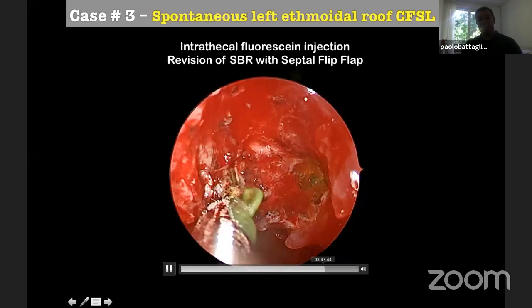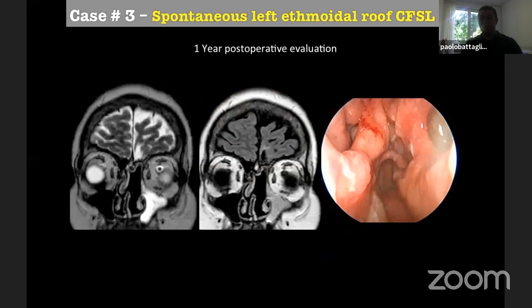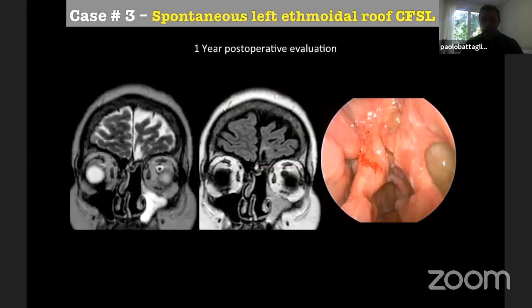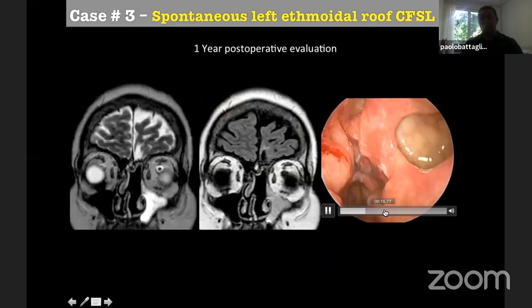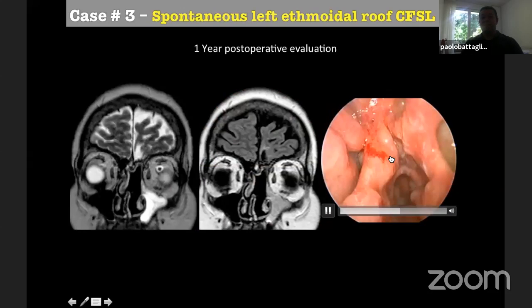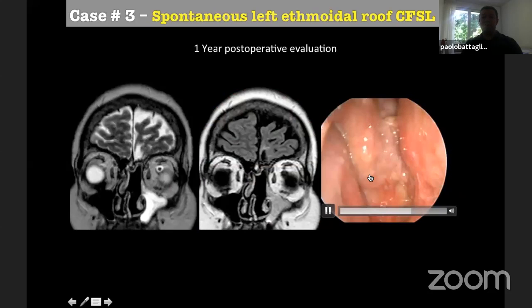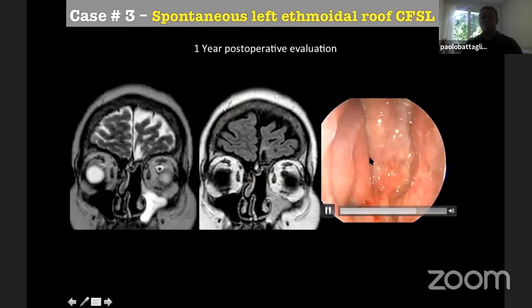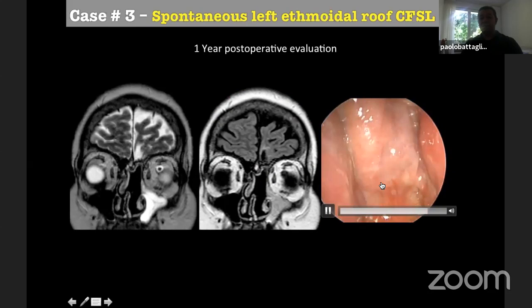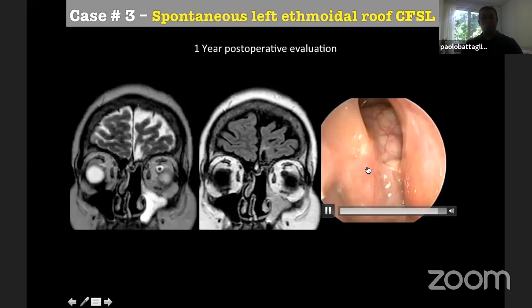And this is the post-operative control. Choana, remaining part of the septum, maxillary side of the left, and here the healing after 1 year. And I hope this will be the last surgery.